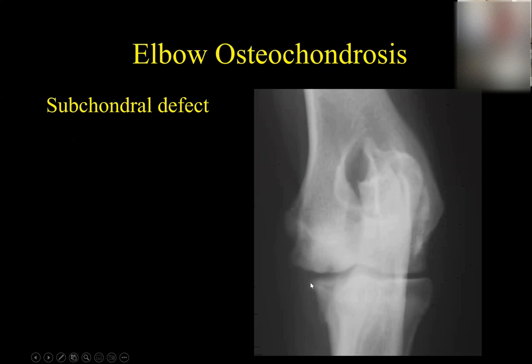These little irregular areas of the bone right in here, this is the start of degenerative joint disease or osteoarthritis or osteoarthrosis, all the same stuff. Okay, so this is the body's attempt. Let's put bone around this joint because something's wrong with it. So these are actually called osteophytes, is the real name for these. An osteophyte, they're usually called periarticular, meaning around the joint, osteophytes. This is a little spiculation of bone that forms here and even some down in here. And these are typical that you're going to see with arthritis going forward, osteophytes.